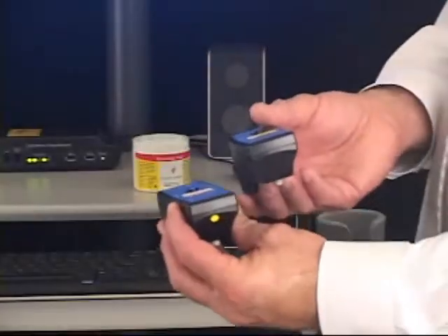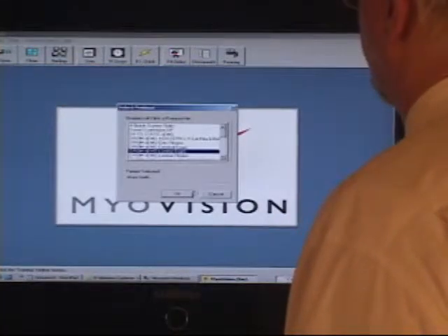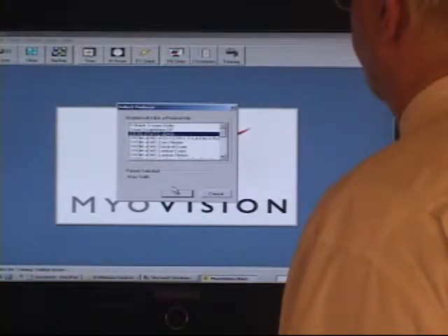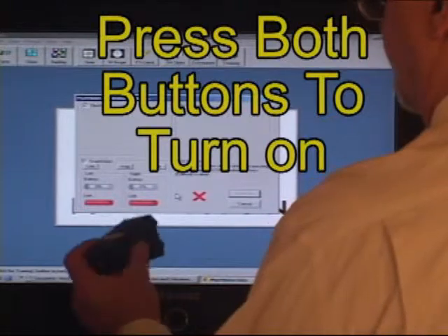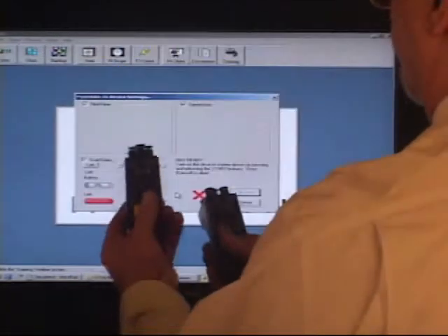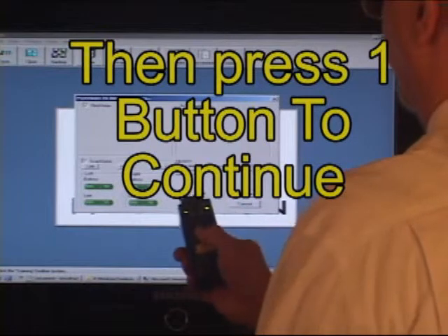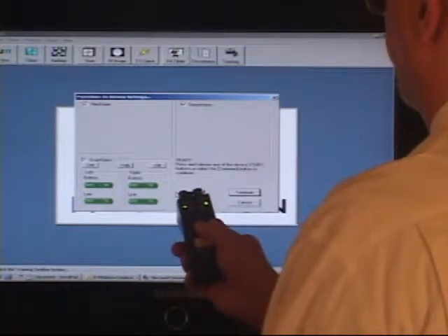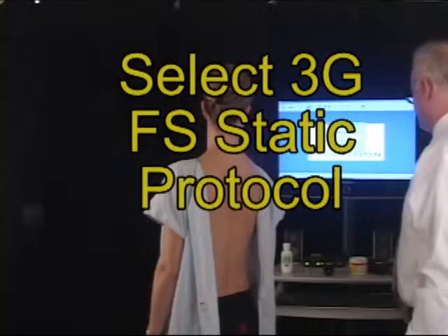Performing a 3G test is simple. The left probe is marked with a yellow marker and the right is without it. You select the 3G full spine static in the software. This shows you the battery levels. You turn both buttons on — just hit them left and right — after making certain that the actual devices are turned on.